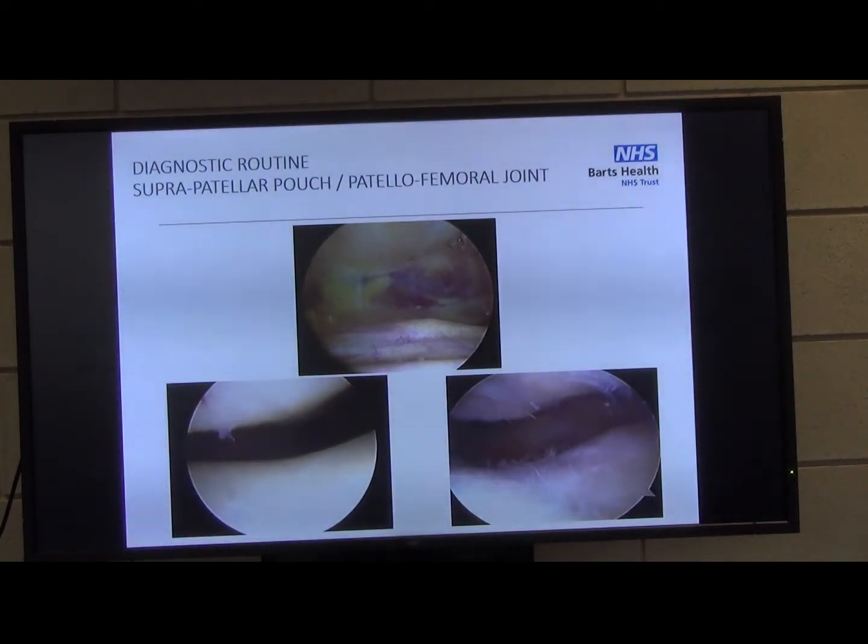I see a lot of operation notes where people write a brief note, they don't describe exactly what the findings are. So any cartilage defects, arthritis, graded, describe it well, because if people are looking at this operative note 2 years down the line, they need to be able to make a decision based on your findings sometimes. With regards to the op note as well, it's quite useful to have a one-line summary plan at the end. Yeah, exactly, at the end, like if you feel a patient would benefit from a uni, for instance, just make that clear, just say it. In a busy clinic, it's very good when you see an op note and someone's made a provisional plan in theatre.